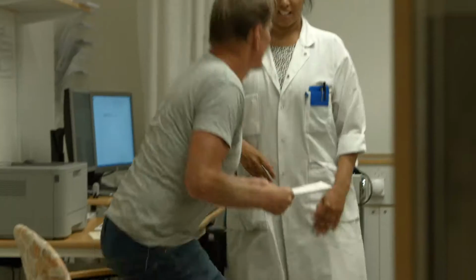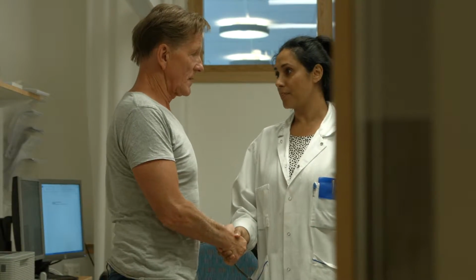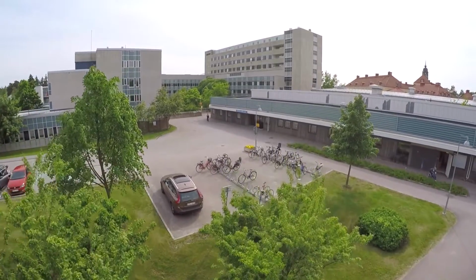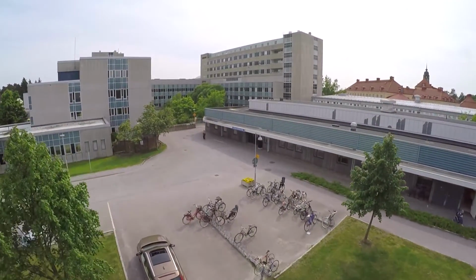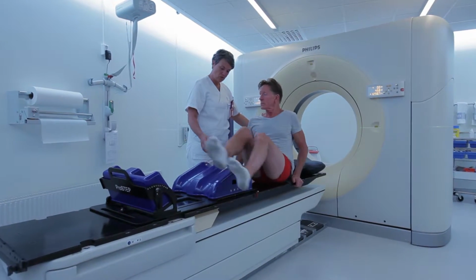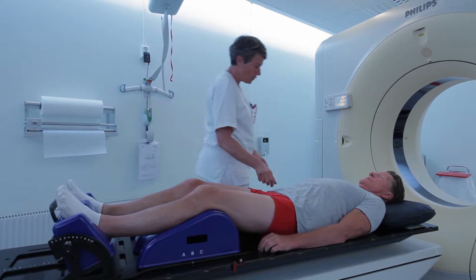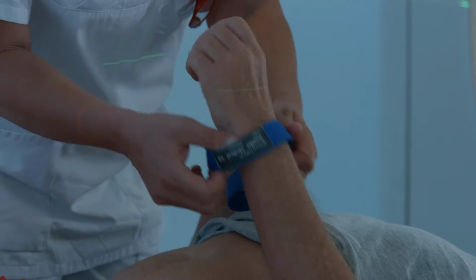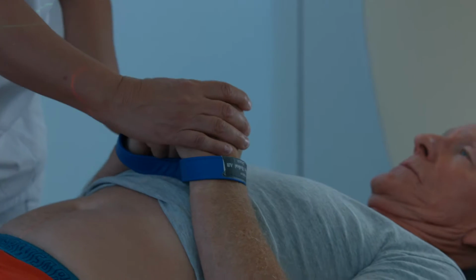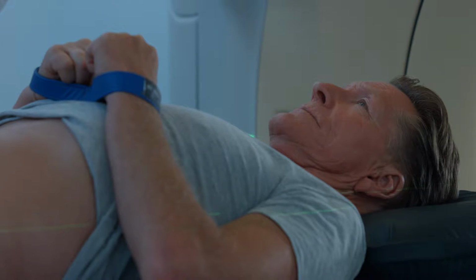At the end of the conversation, you will get an appointment for treatment planning, typically occurring within 3 to 5 days. When planning, we use a planning CT, computerized tomograph. During the examination, we will test individual positioning, which will then be used during treatment so that you are always treated in the same position. It is important during the radiation that you remain still on the treatment table. A therapist will be present to assist you in the process.